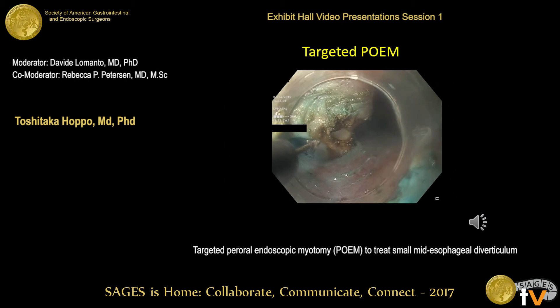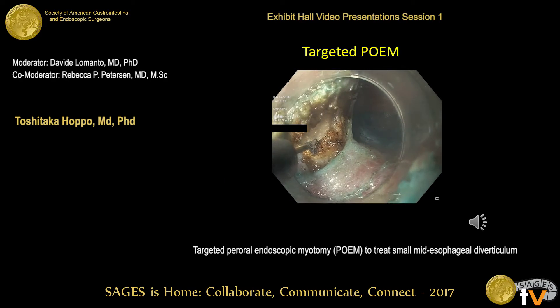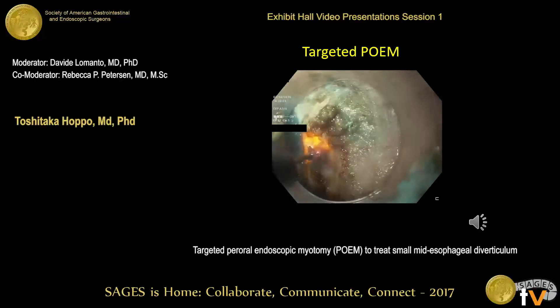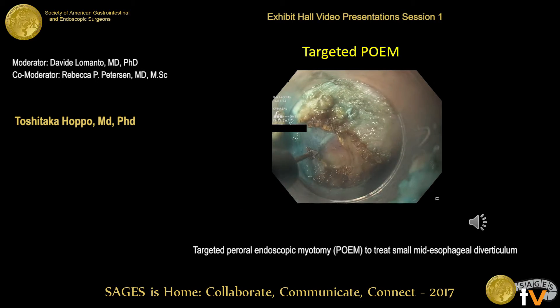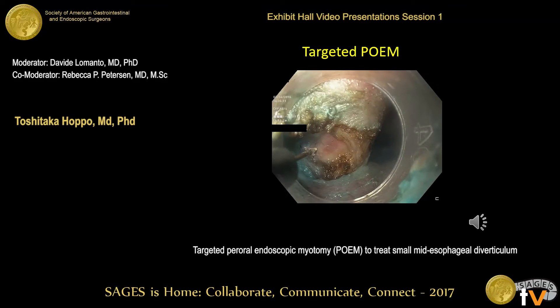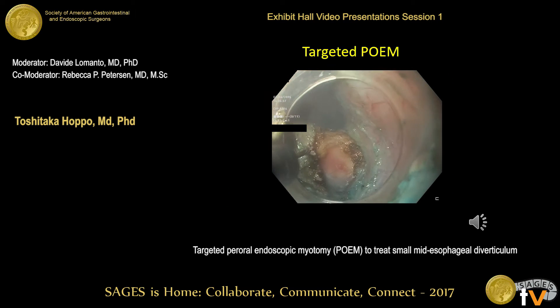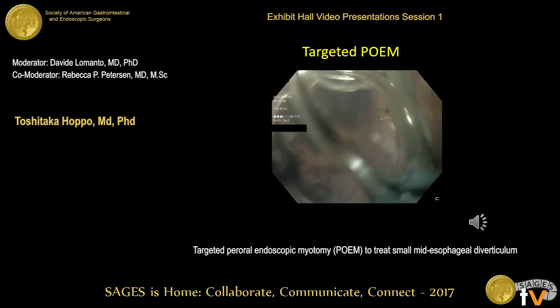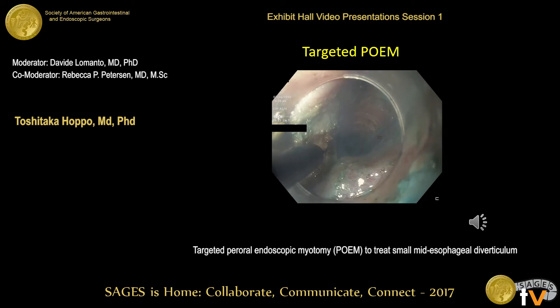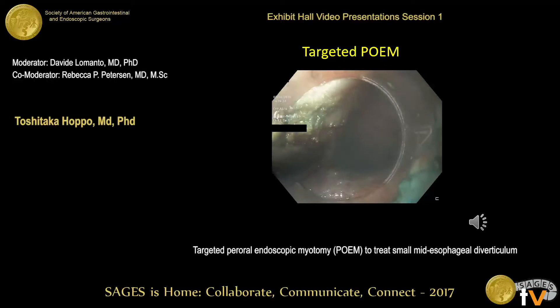Now you can see the bronchus right behind the muscle band here. I tried to completely divide this muscle band. This is the bronchus right here — it's actually a very scary view. Once I completely divided the muscle band, I extended the myotomy approximately two centimeters distally to complete the myotomy.